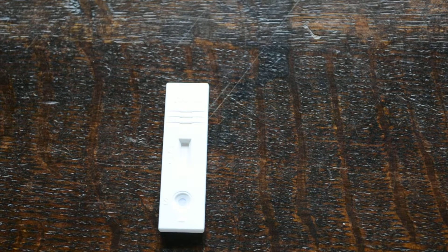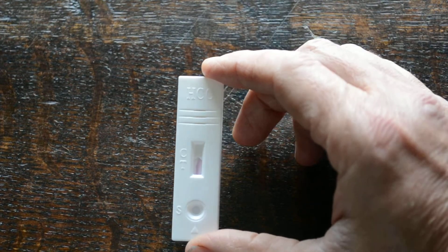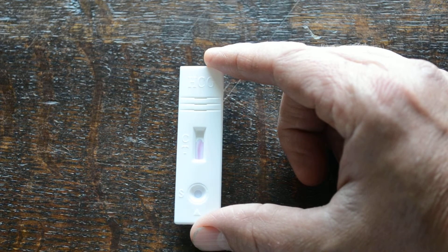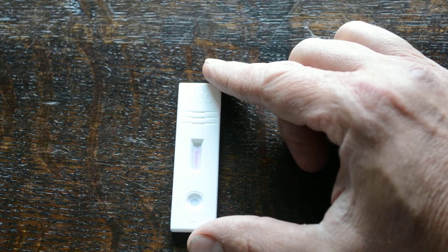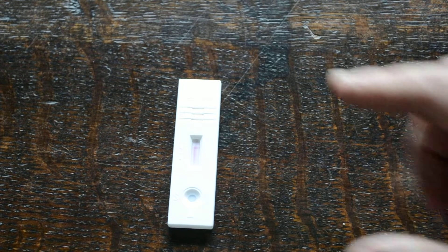We've just got to wait now for the membrane to run. What you'll see starting in the results window is the pinkish dye beginning to travel up the cassette, passing the test area and control area where a couple of lines will form. It takes about one to two minutes to pass osmotically through the test window. There can be a little variance depending on how much urine you've added and how warm it is.